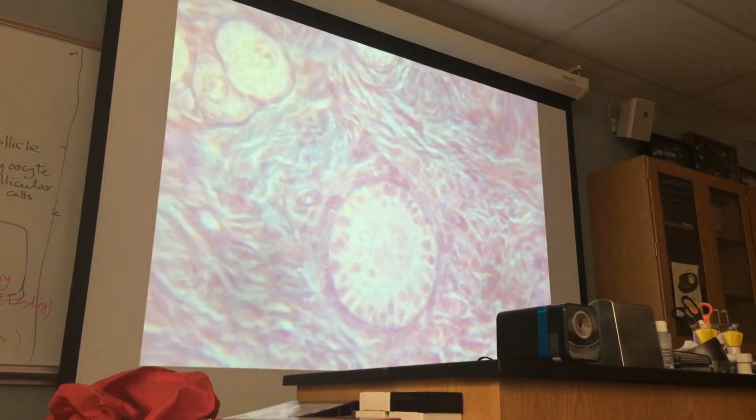Follicular cell. Remember? Okay. If I ask you, is this a follicular cell? No. What is this cell? Fantastic, granulosa cell. Very good.